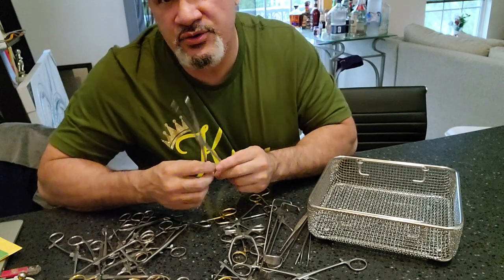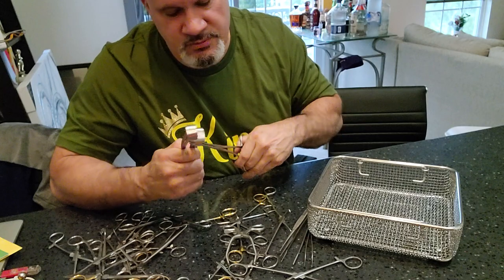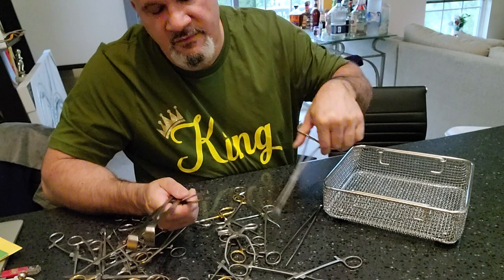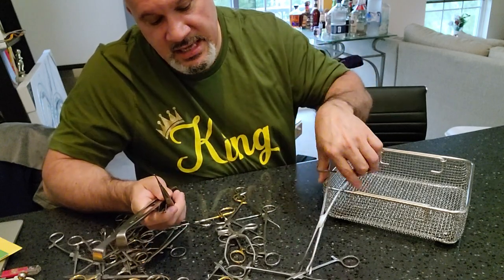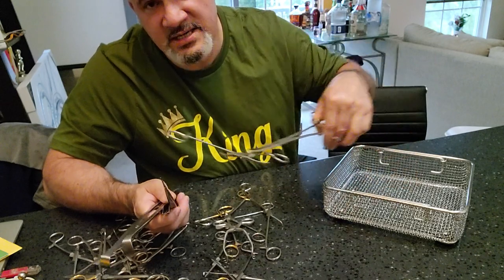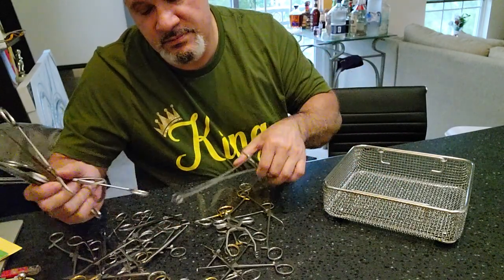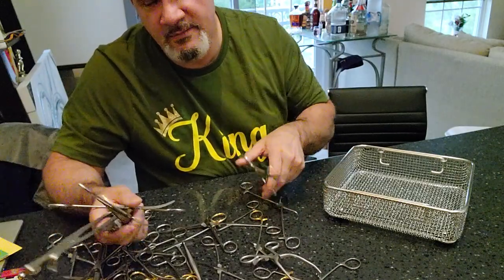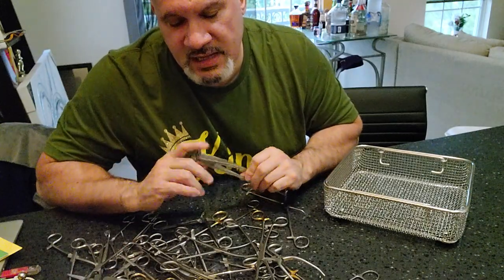Now if you look at some of our training videos, they tell you that you can use a sponge stick to grab instruments. But in the 10 to 11 years I've been working, I have never seen anybody do this. What I do see people doing is something else entirely.